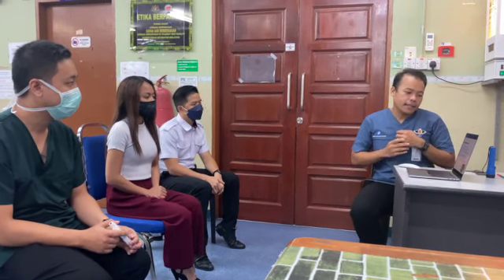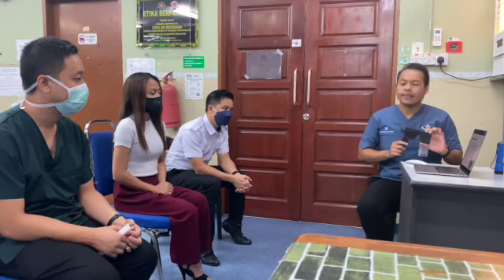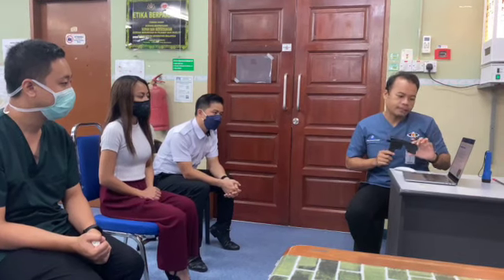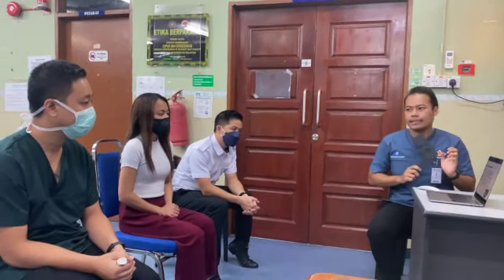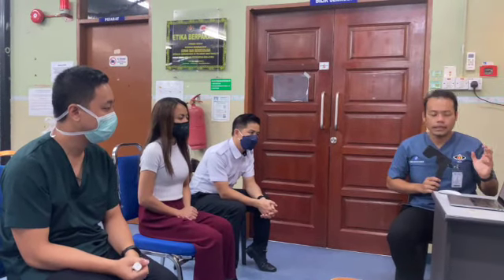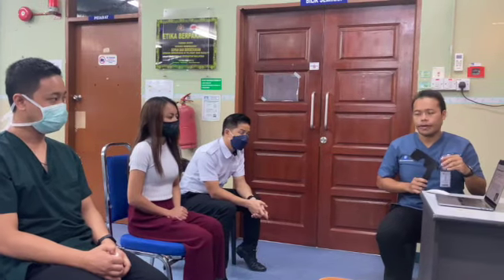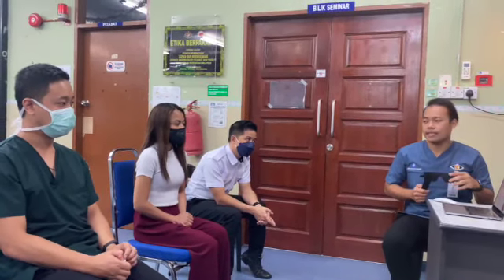The patient will cover their right or left eye with the pinhole occluder, either left or right side, and read the chart starting from the top to the bottom of the Snellen chart. Then they will switch the eyes and repeat the same procedure, from right and left, from top to the bottom. I will demonstrate how we are going to perform this test.